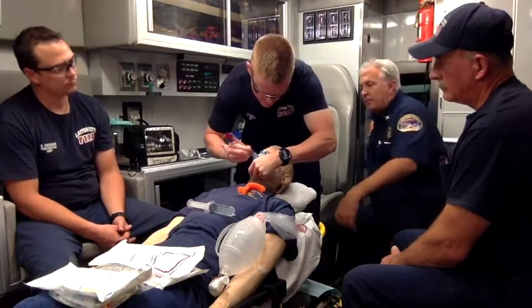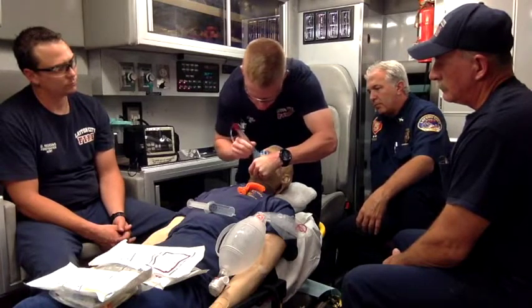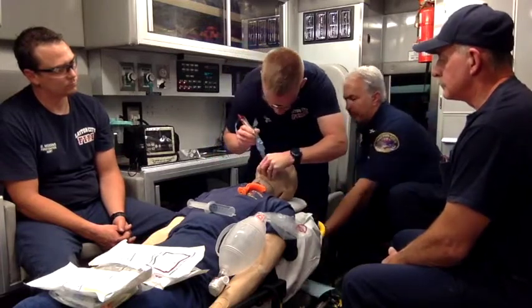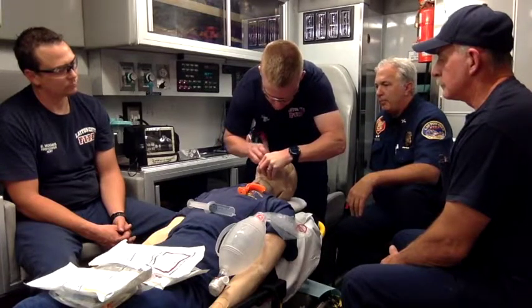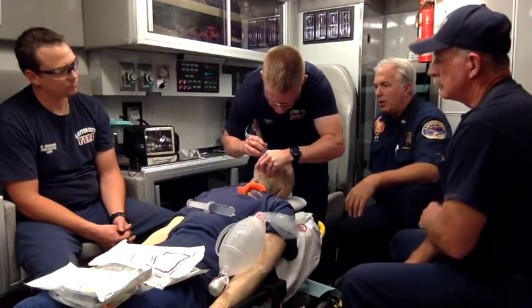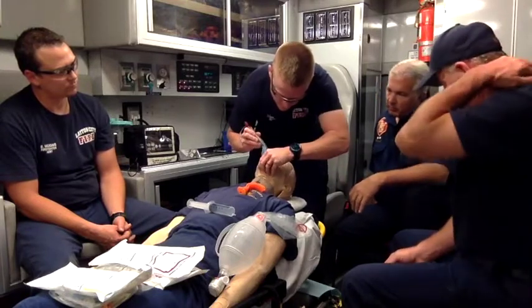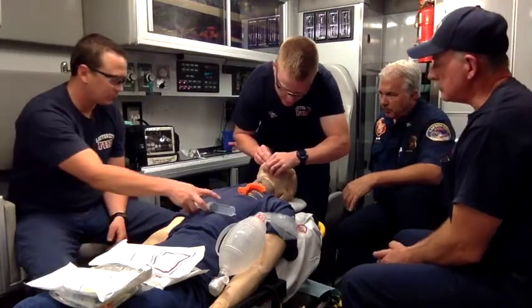Once we get that past, then we'll twist it to where that blue line will go a little towards the chin. Try to set that just a bit. There you go. This guy's a little harder to do. His mouth opening's smaller than the Laerdal mannequin's. Okay, so keep walking us through it. So we keep it twisted, drop it in, and we're going to get it to the base.